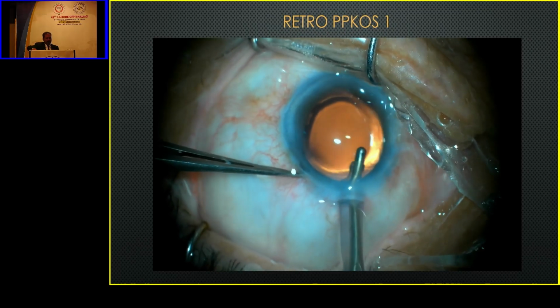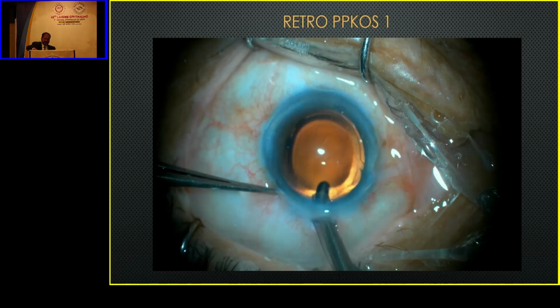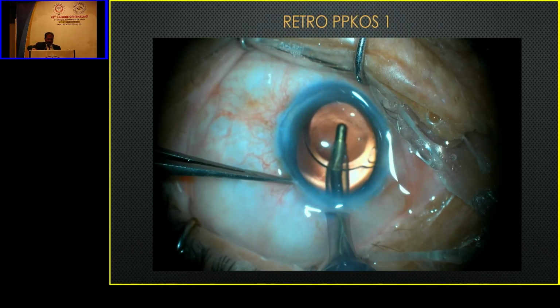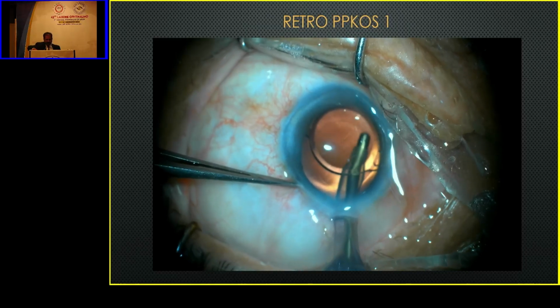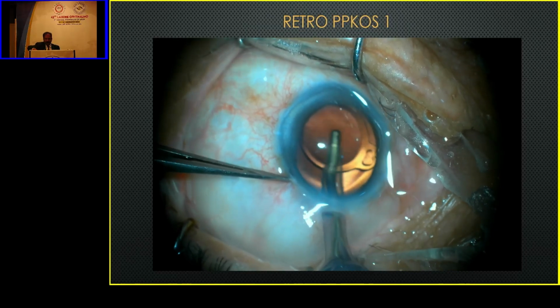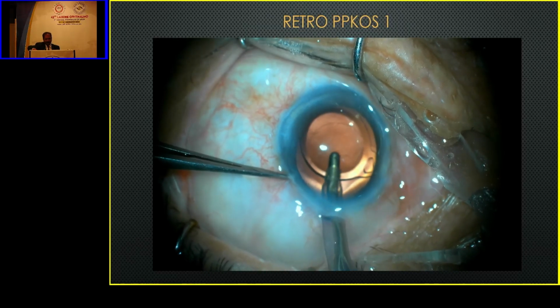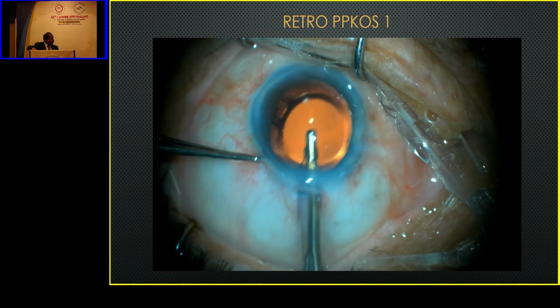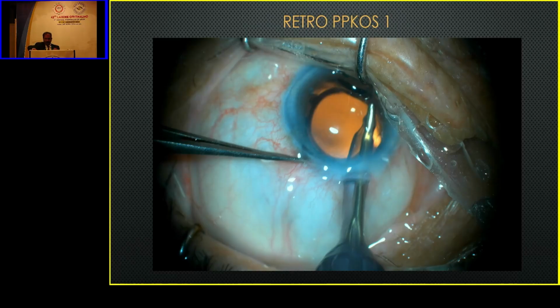And where not to go behind the lens? Are there any contraindications? There are few only. Torn rhexis is an absolute contraindication. Don't go behind the lens when the rhexis is torn. Or there is suspected PCR, posterior capsule rent, don't go behind this. Or there is subluxation, or you suspect some dehiscence of the zonules, don't go behind this.